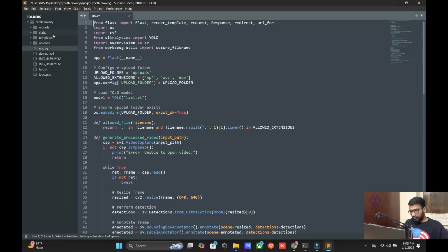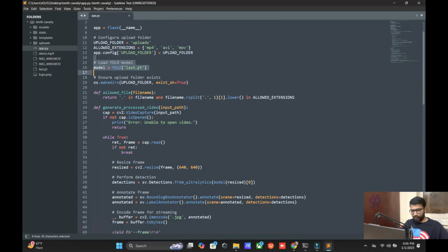Our project is open in Sublime, and you can see we put the code and the libraries that we need to install first on our laptop, and your configuration format, the format of your uploaded videos. Okay, we decided on three formats here. Your model I already showed you in the last.pt file. Ensure your uploading folder exists.